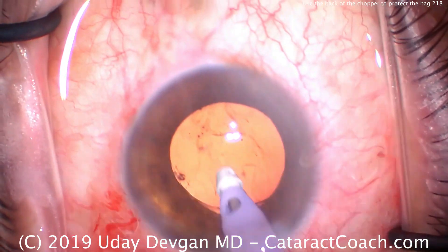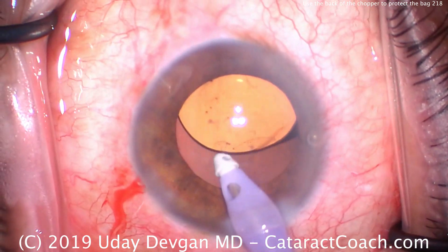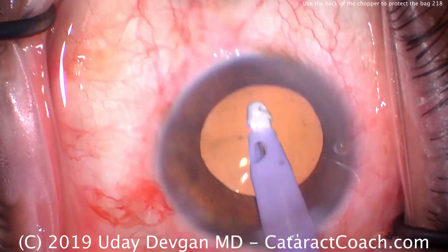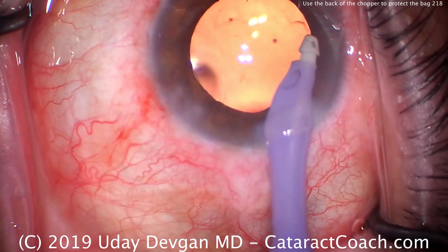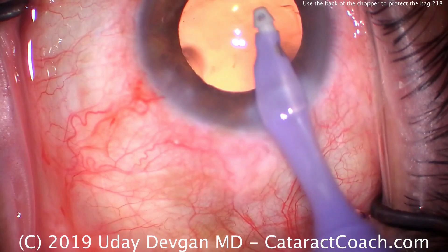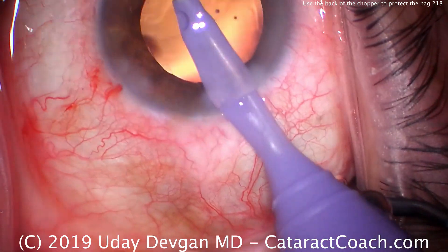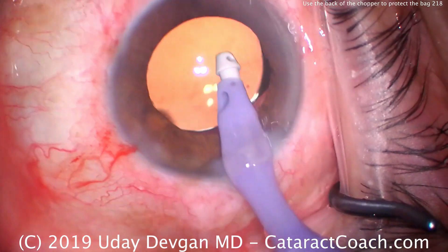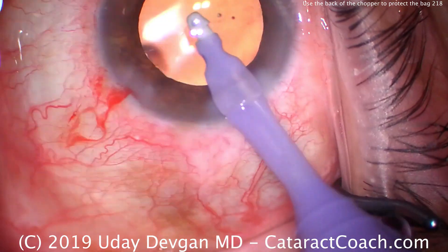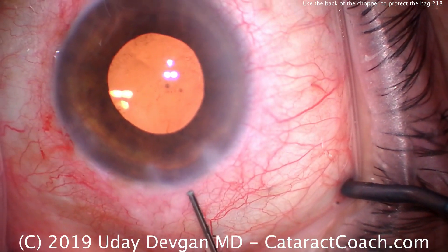We'll finish up the case here, going behind the IA to remove viscoelastic. The most risky part of the surgery in terms of having the posterior capsule come forward is during phacoemulsification — when we have the metal phaco tip inside the eye and we're using ultrasonic energy to break up the nucleus. This is where we have to be careful. When we take out half the nucleus and half is in the bag still, that second half weighs down the bag. It's only when we remove the last bit of nucleus — where nothing is left to hold the capsular bag in position — that we really want to use the smooth backside of our chopper as a barrier to make sure the posterior capsule doesn't come forward and contact the phaco tip.